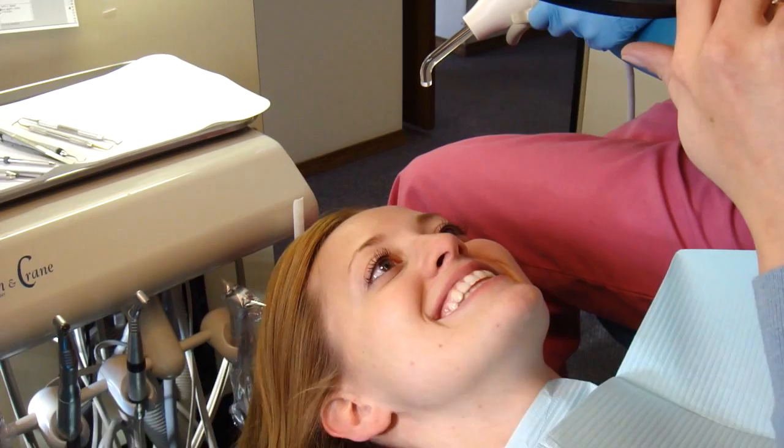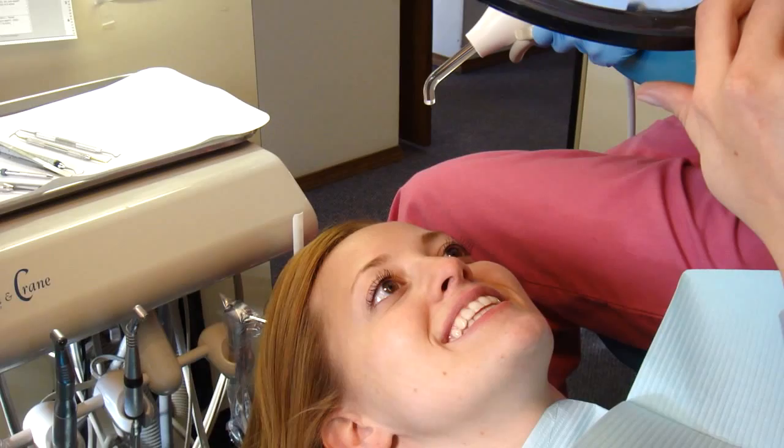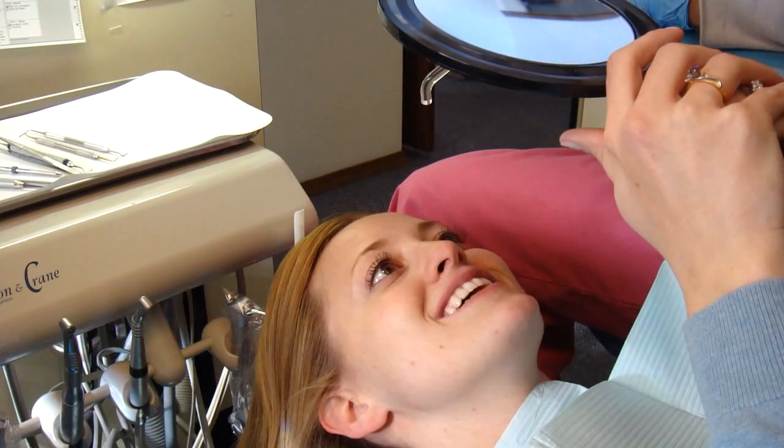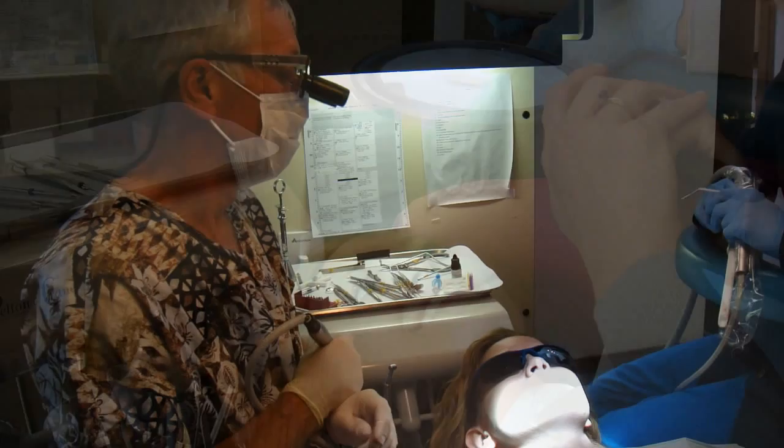And then what we might have to do a little bit is change your bite, right there. Because I was looking at how your teeth meet together, so we've got to make sure that everything fits. Don't worry about how it feels now, because behind where you can't see there's all kinds of extra stuff. Oh my gosh, that looks so good. Can I wear this for the rest of the day? Sure. Oh wow, that's so cool.